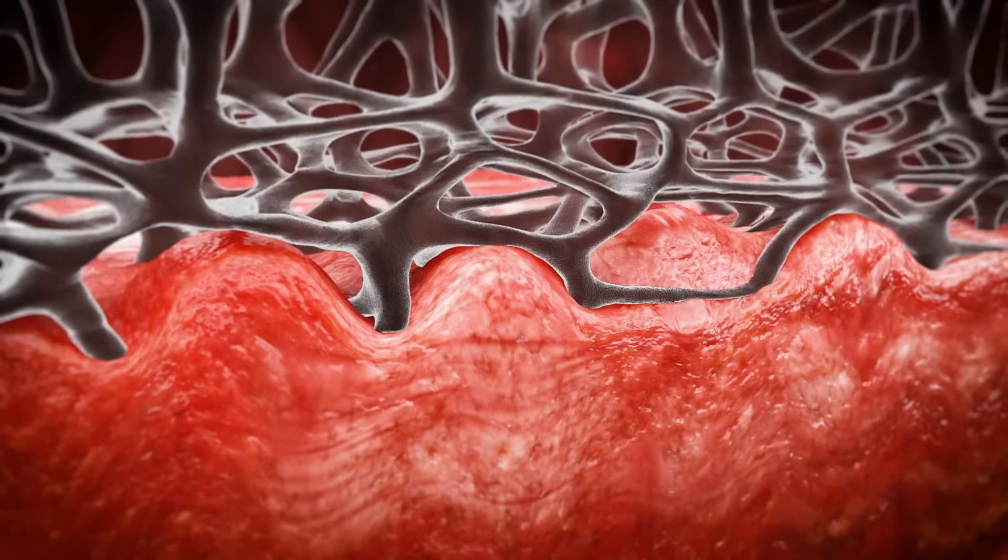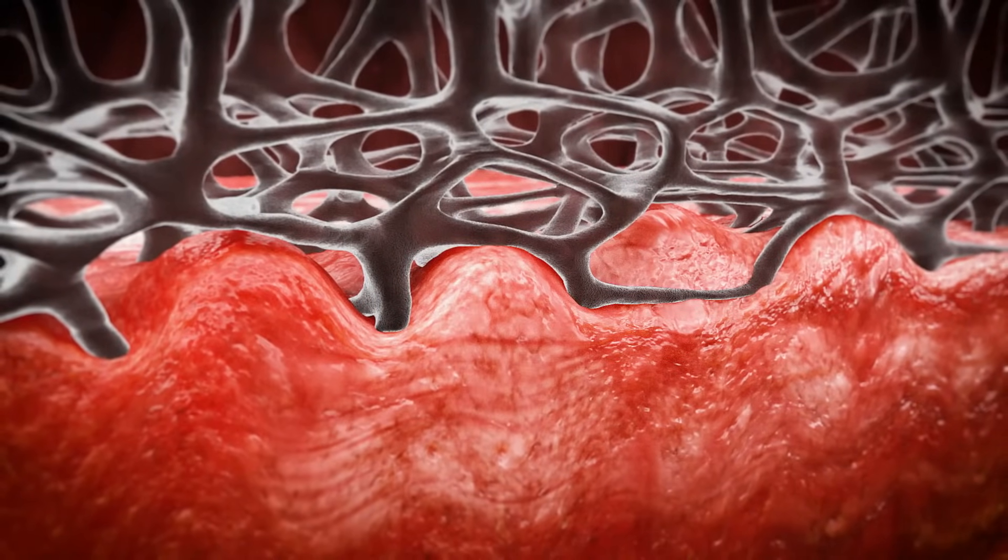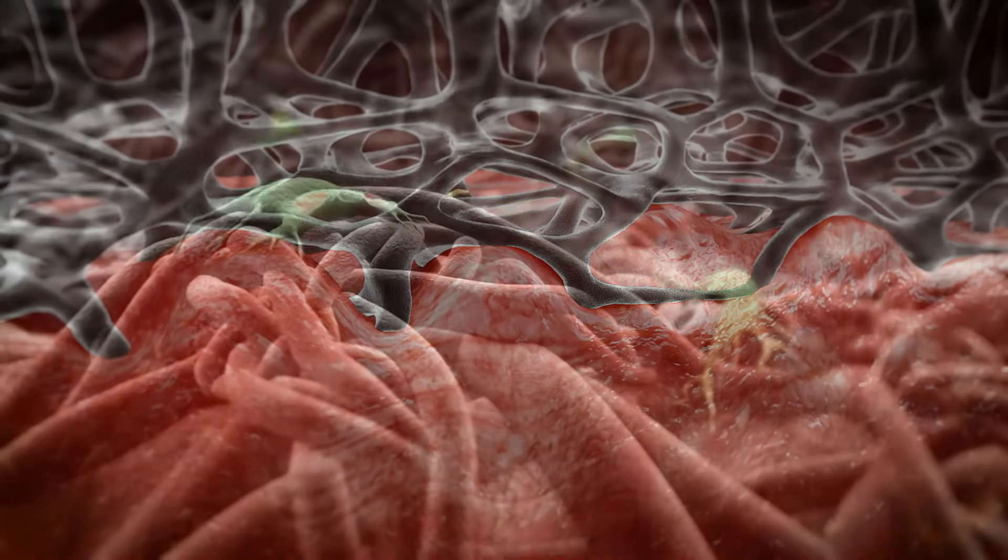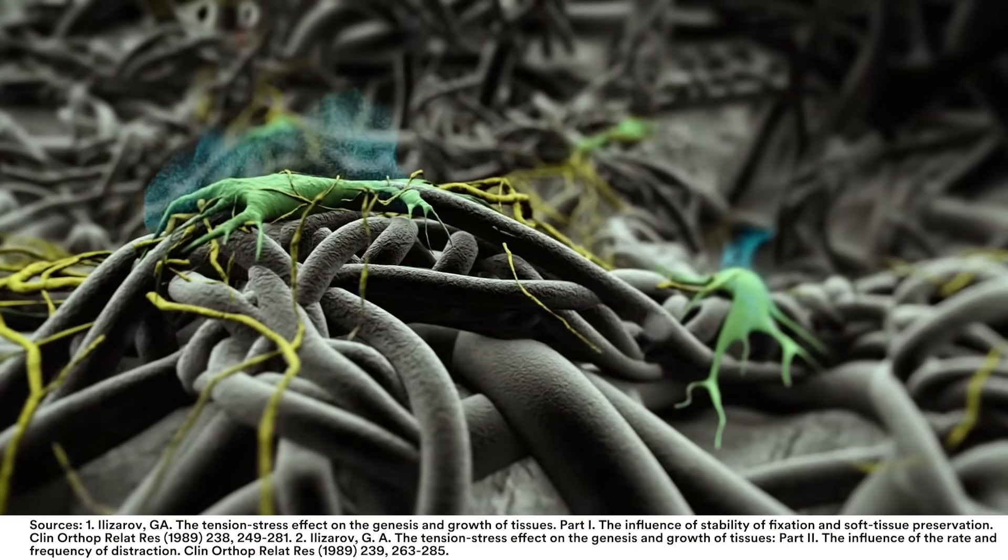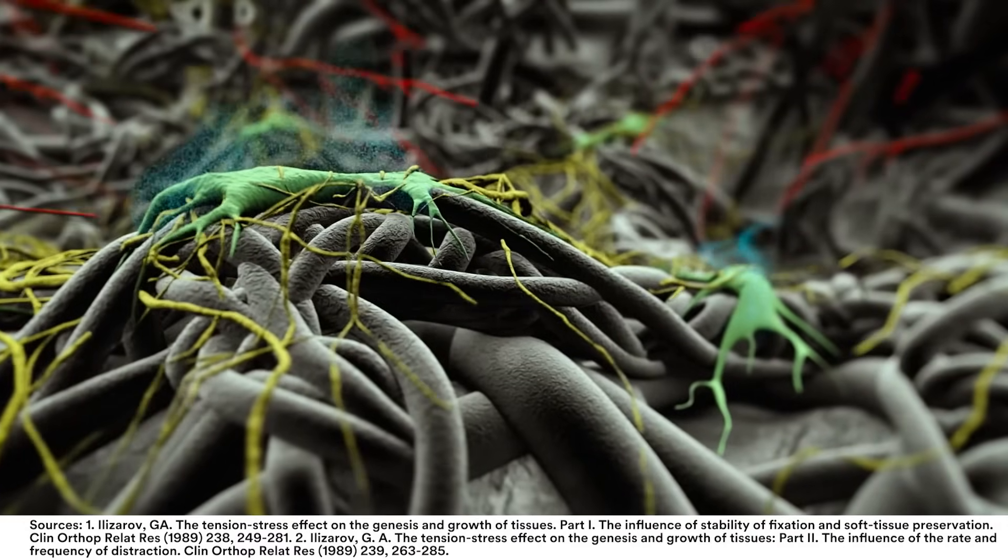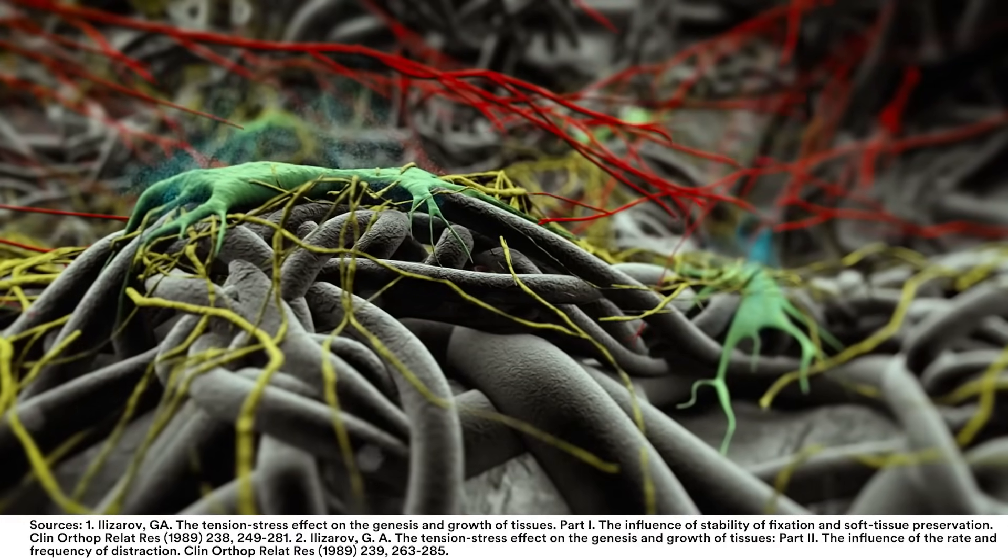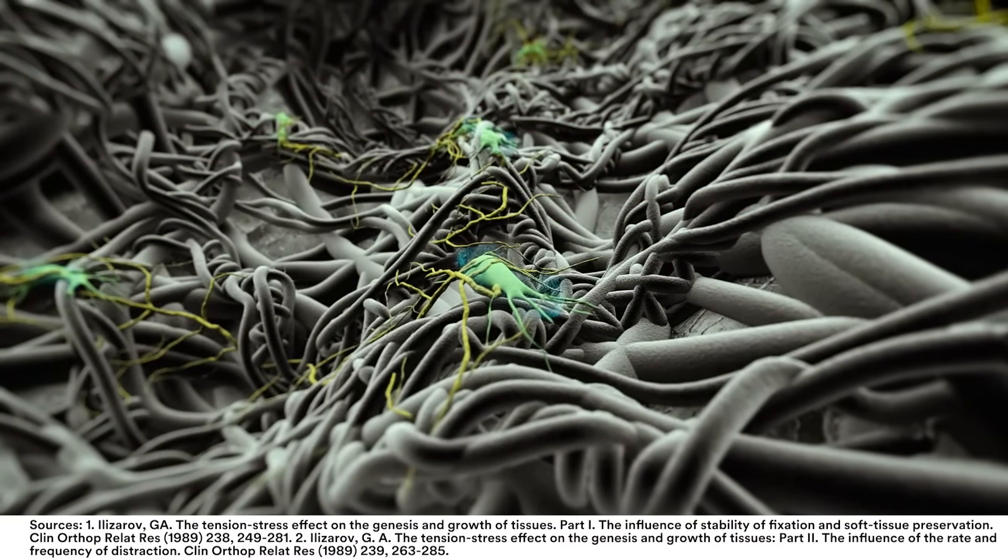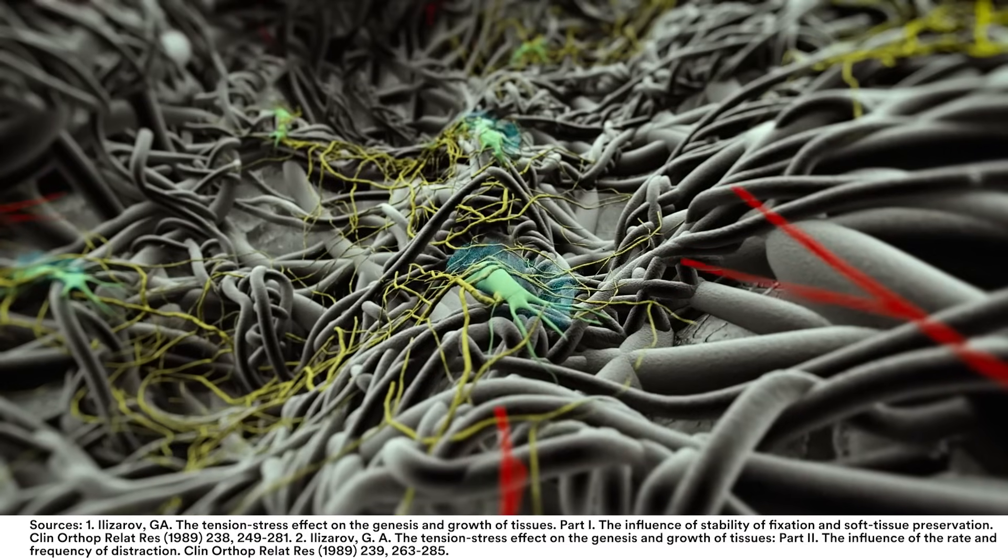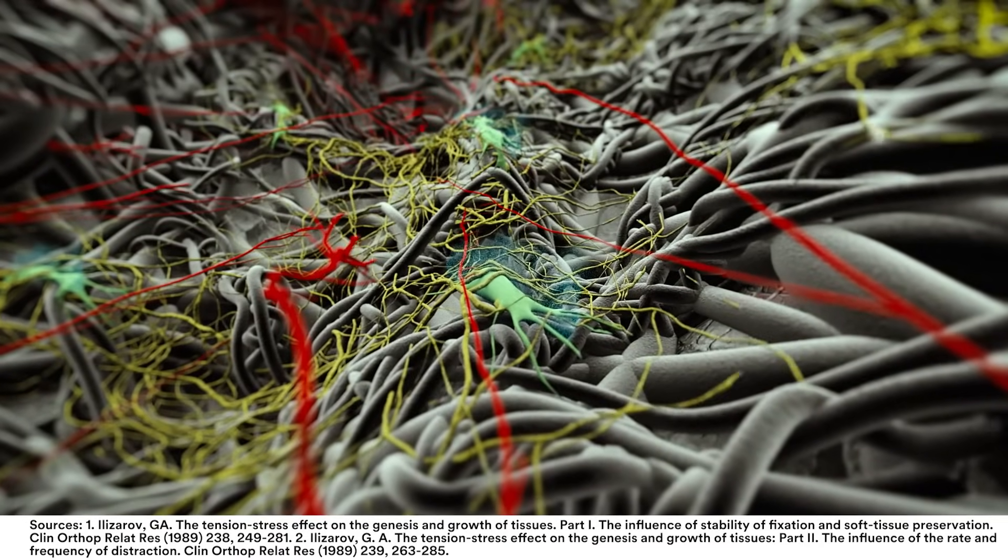Tissue micro-deformation at the cellular level leads to cell stretch. When cells of any kind are stretched, they are stimulated to expand, become thicker and more metabolically active. This response to cell stretching has been well documented and is clinically used, for example, when tissue expanders are applied to stimulate the formation of new skin.